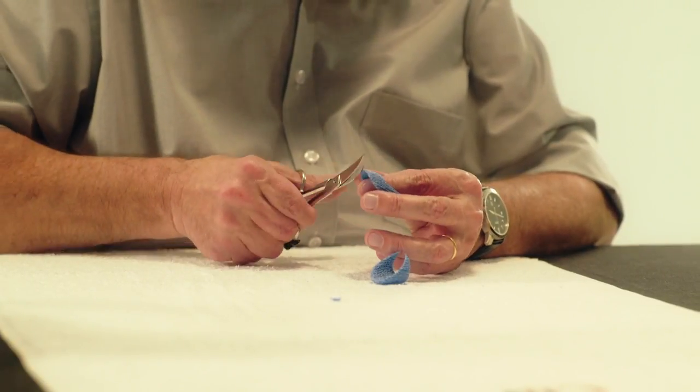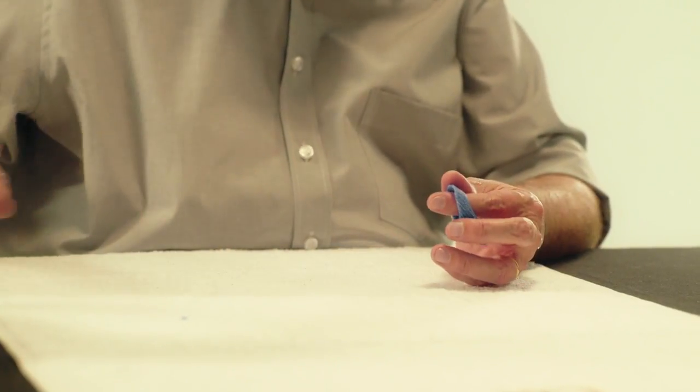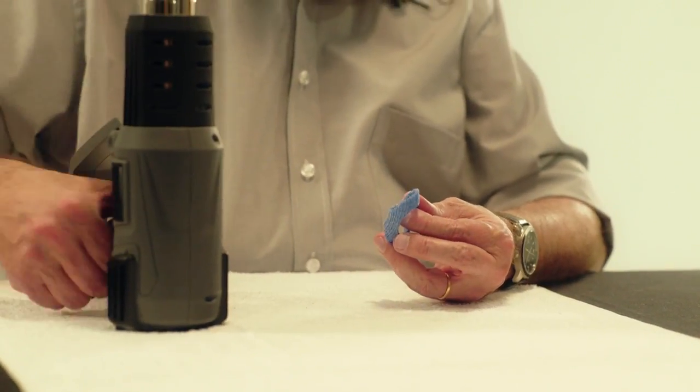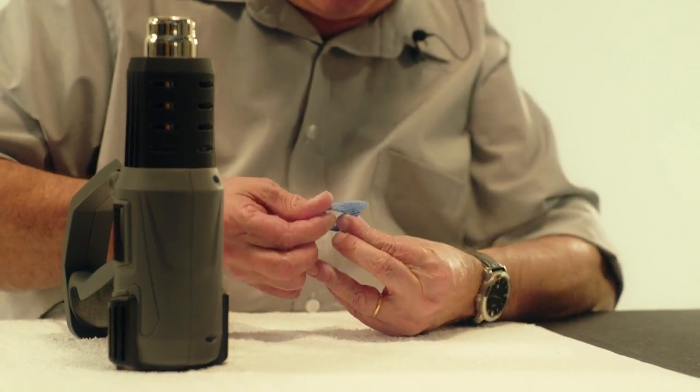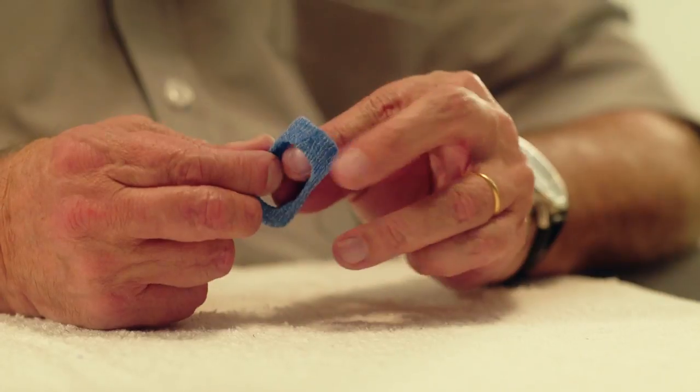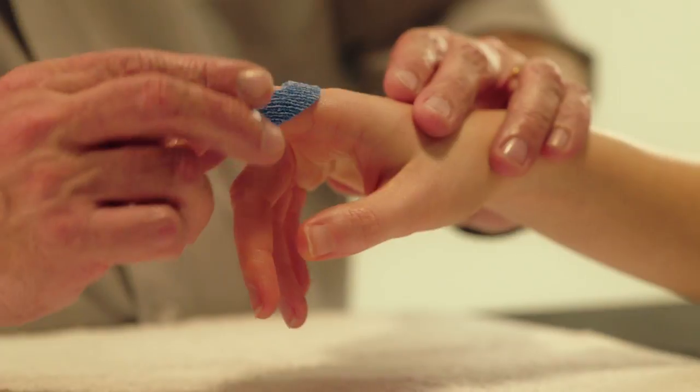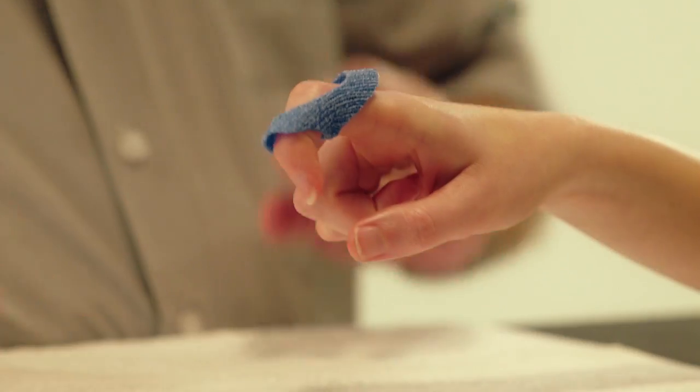Heat the material covering the flexion crease of the PIP joint with a heat gun and slightly pinch together. The orthosis can now be fitted onto the patient's finger.